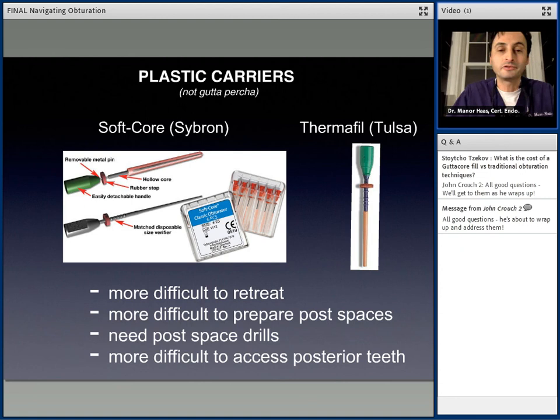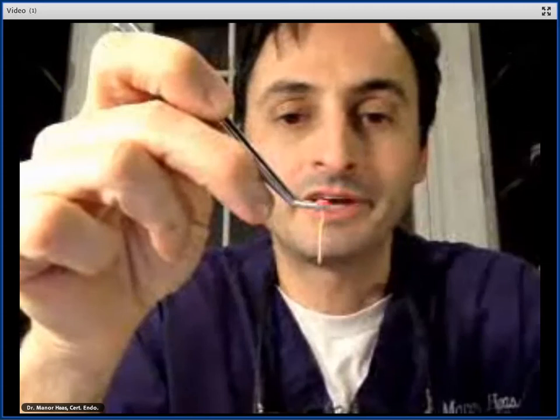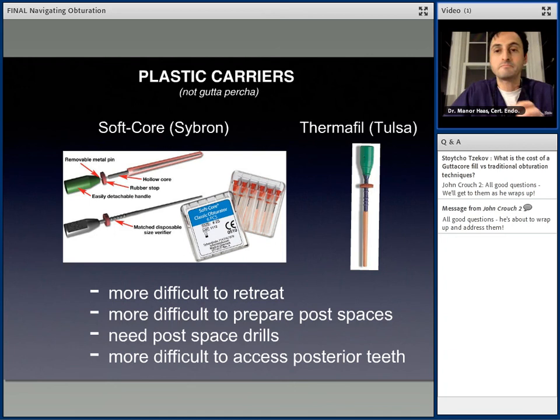There's no reason, since they have been engineered so nicely. This thing again, and if you want a post in there, it's all warm. And what I do, break. Now, isn't it easier to obturate this with any of the guns or anything else that you might have? That's to break that off while still warm, gutta percha based carrier, brilliant.